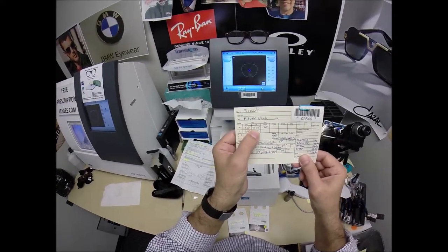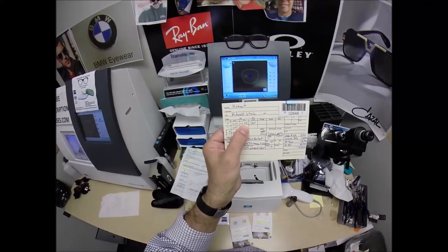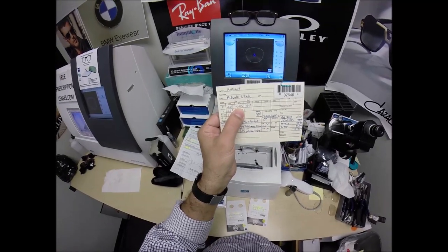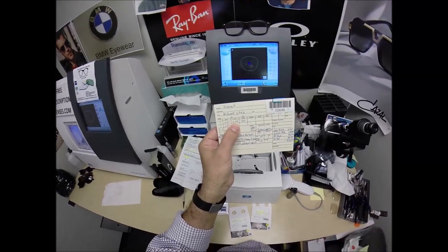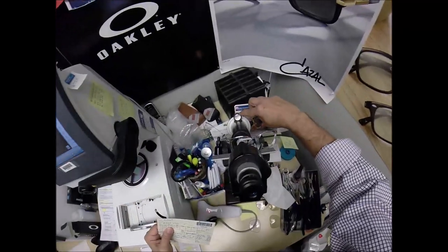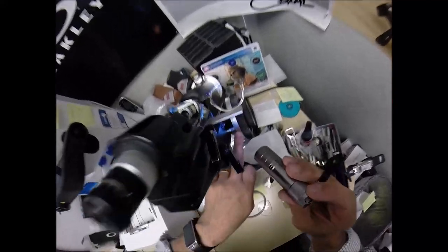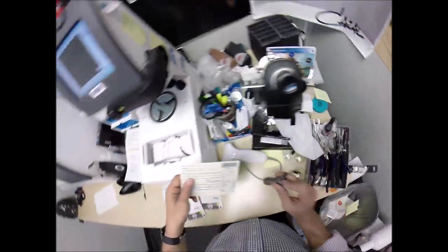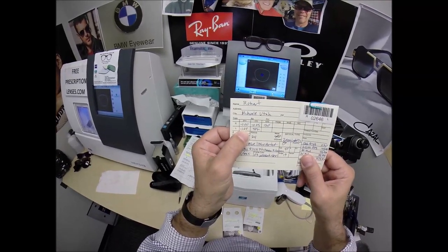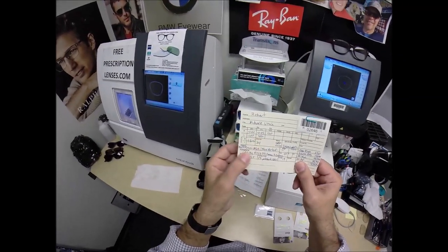Now, once everything is the correct size, you have the smallest amount of astigmatism correction you can have. Uncorrected astigmatism makes sixes and eights look alike, with the letters P and F. Think of it as the fine tune knob, and we're going to turn that fine tune knob to 120, which I've already done. But let's check the second curvature, and we're at minus 1 1/4. Same amount of nearsighted correction for the left eye, four steps, but you need no astigmatism correction for the left.